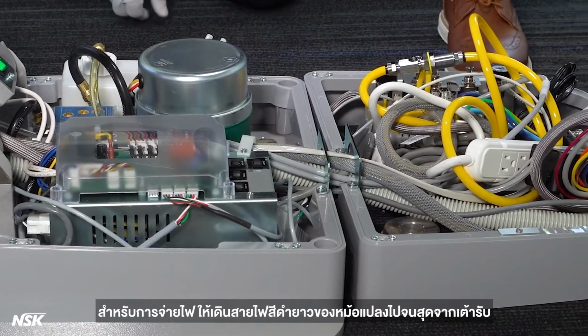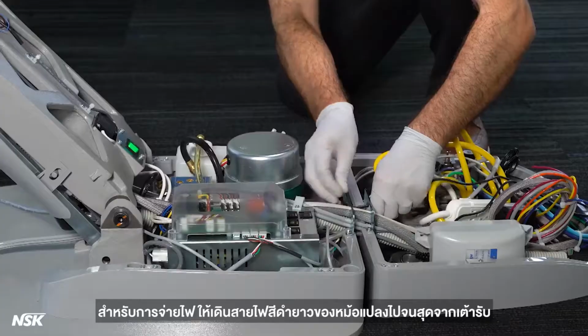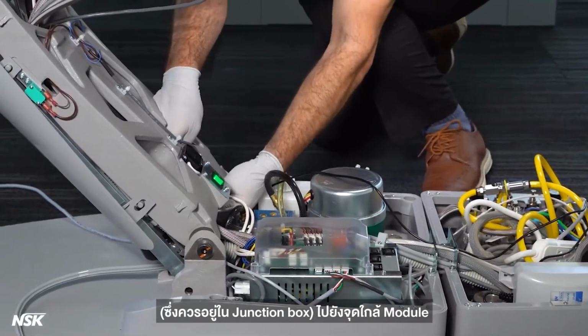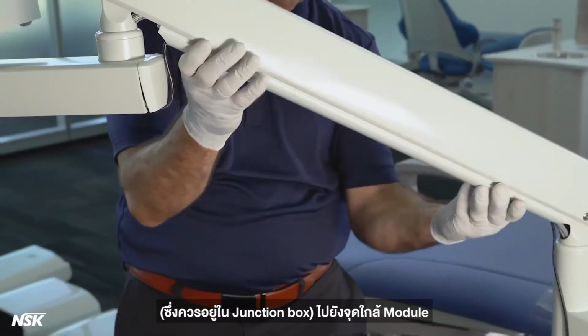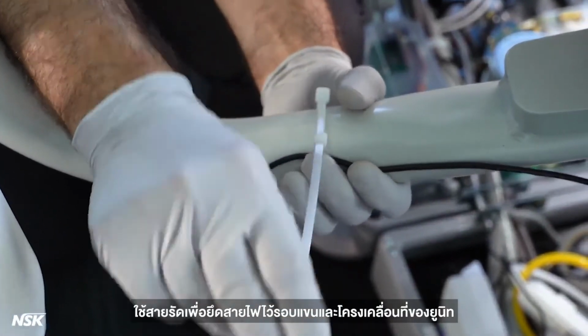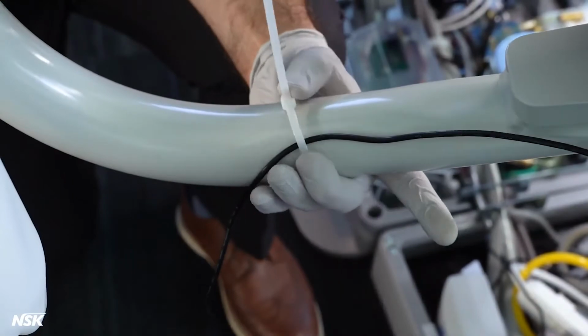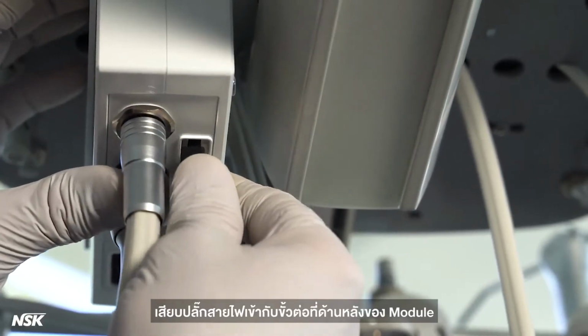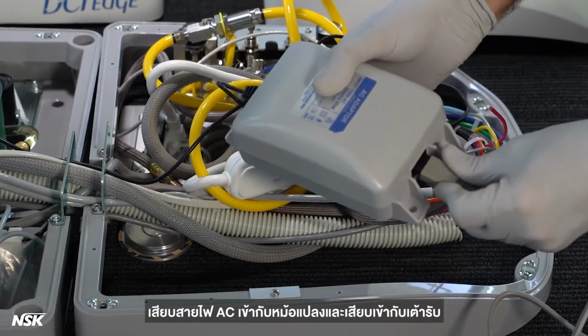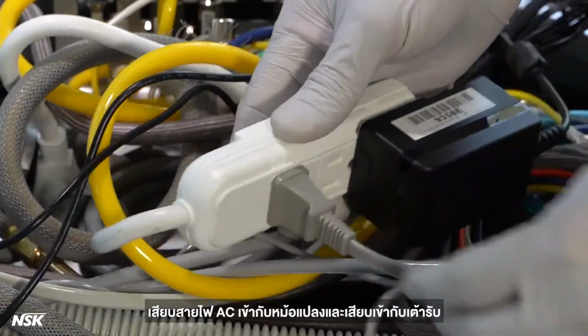Now, for the power, run the long black cord of the transformer all the way from the power outlet, which should be in the junction box, to a point near the module. Use zip ties to secure the cord around the arms and moving frame of the delivery unit. Insert the power cord plug into the connector at the back of the module. Insert the AC cord into the transformer and plug it into the outlet.